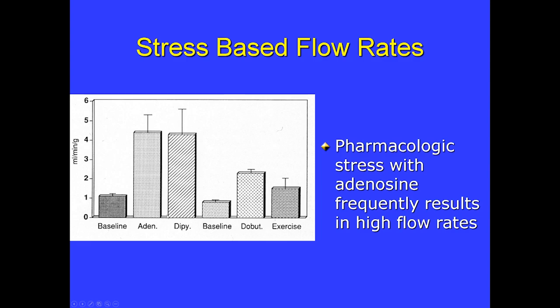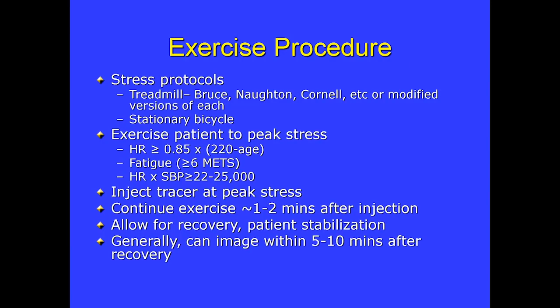We can see that when we stress patients, whether with exercise or pharmaceutical stressors or vasodilation, the myocardial blood flow does increase significantly, specifically with vasodilators such as adenosine and dipyridamole. So all that I've talked about, the roll-off and the extraction fraction, do come into play in being able to determine ischemia. But like I said earlier, despite all the limitations, we do tend to find ischemia for the most part fairly regularly.